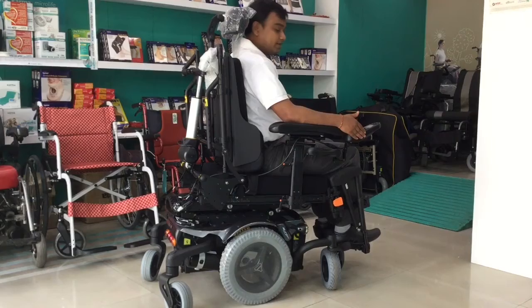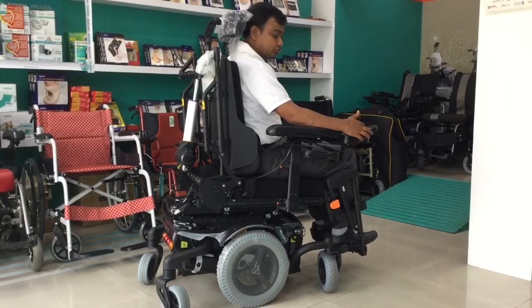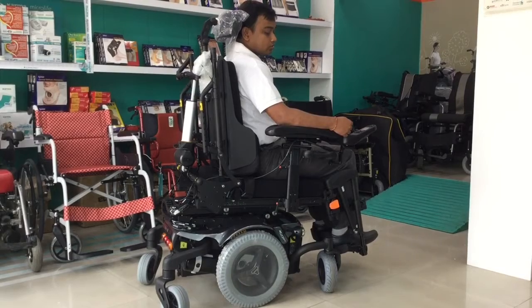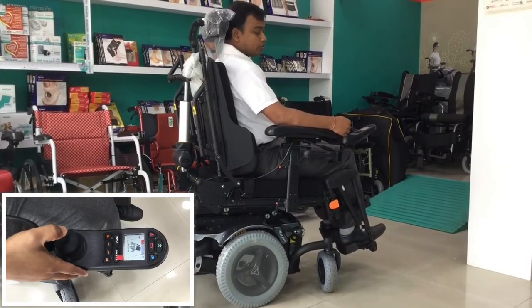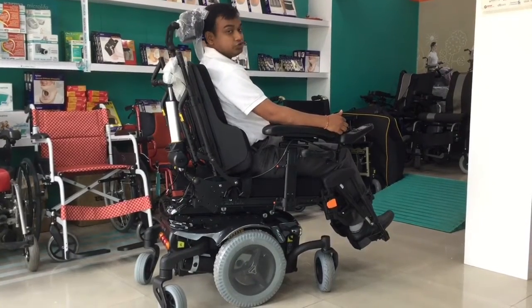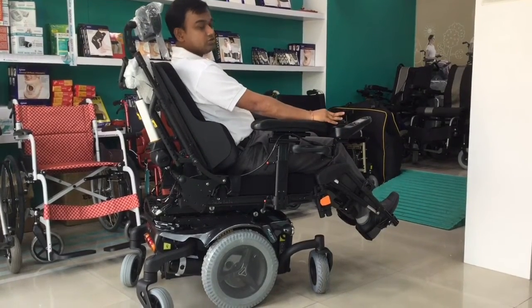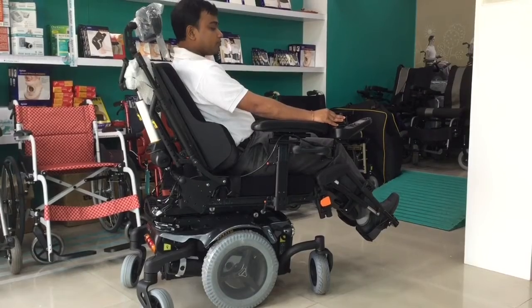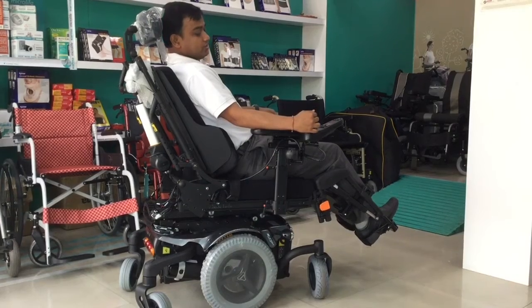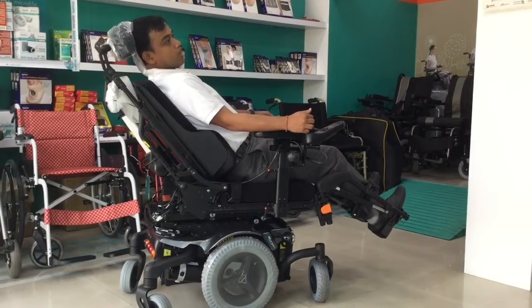The next feature in Morgan Kicks is the power recline. To do so, you need to adjust the function in your joystick, and with the help of this knob, you just move a little bit backward. You can notice my backrest as well as my footrest is changing position. Sometimes while you are reclining the wheelchair, you might have a problem reaching this knob. So Karma provides a swing-away joystick option which solves this problem very easily.